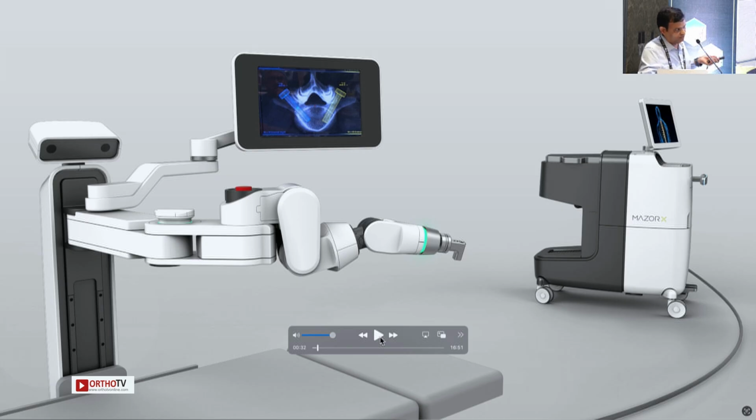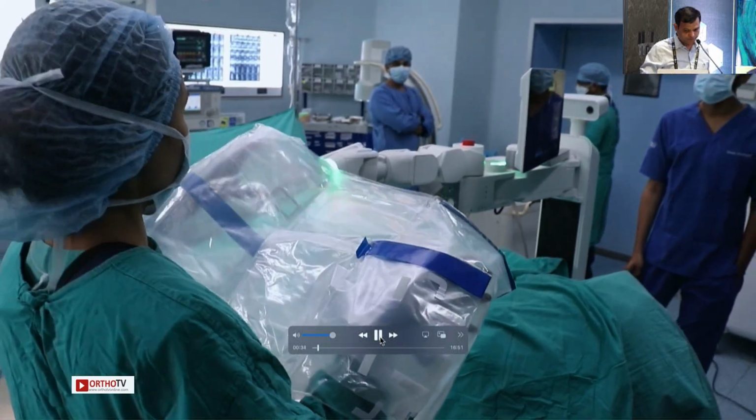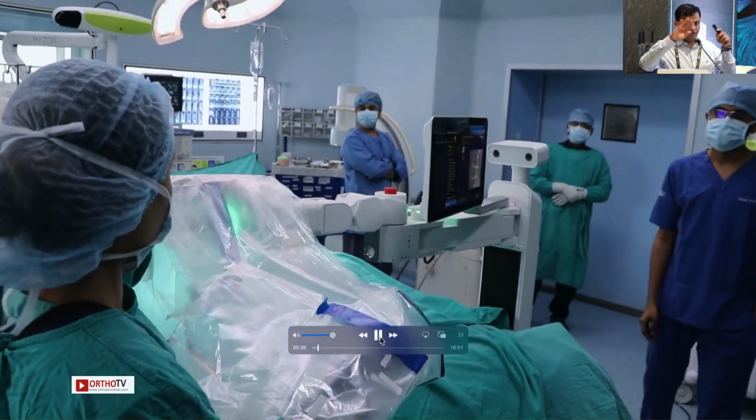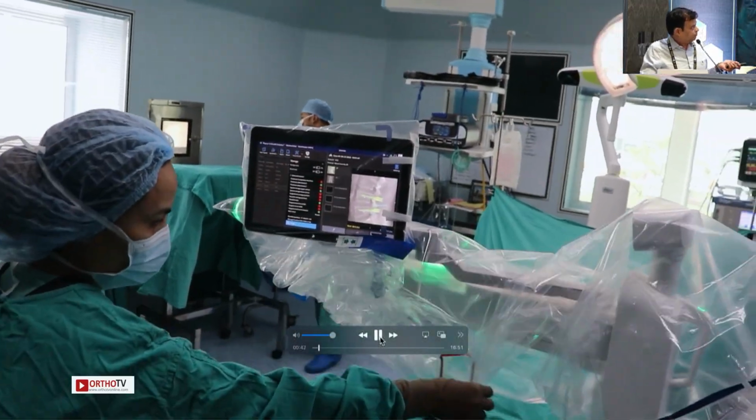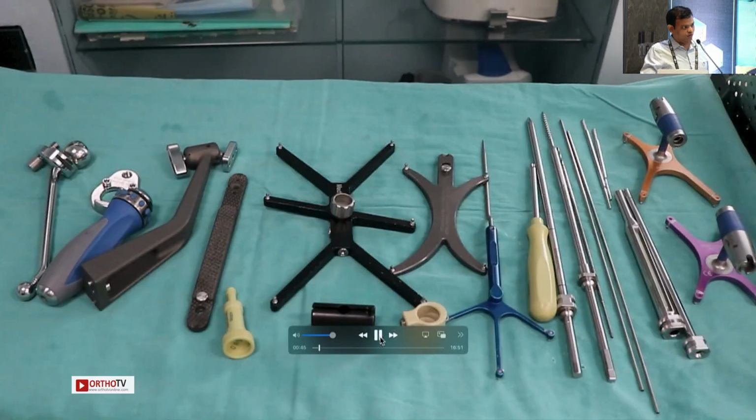That's the camera. Basically, it's 2 cameras through which the robot senses the movement, all the topography, and a 3D defined scan is done through that. And the robotic arm does have a few cameras here, like 3 to 4 cameras, and that helps us in having a 3D defined scan. And that's the draping, which is specially made for Mazor, and that's one of the most expensive parts of this surgery, the drapes and the tracker.